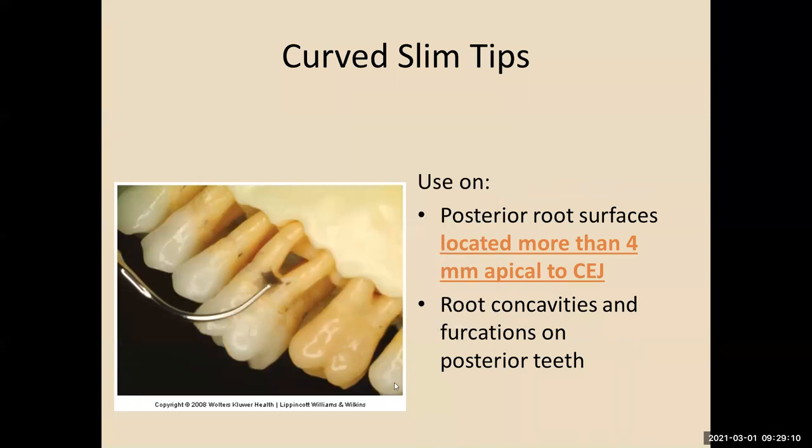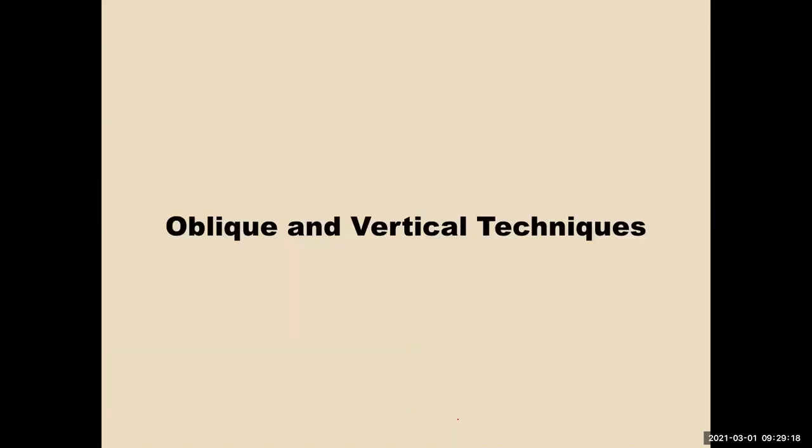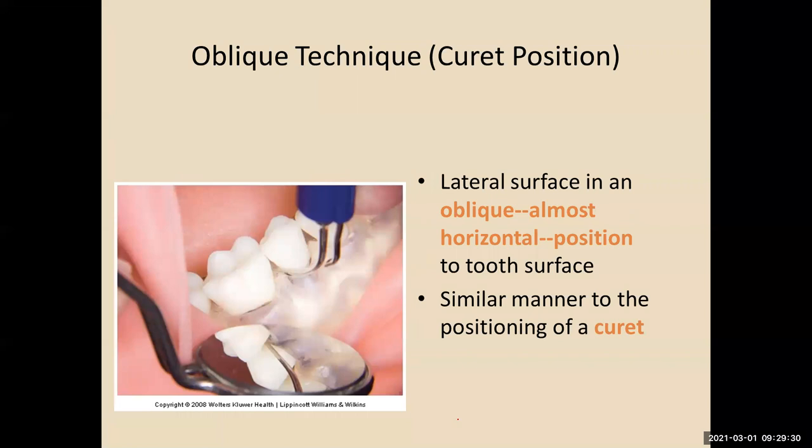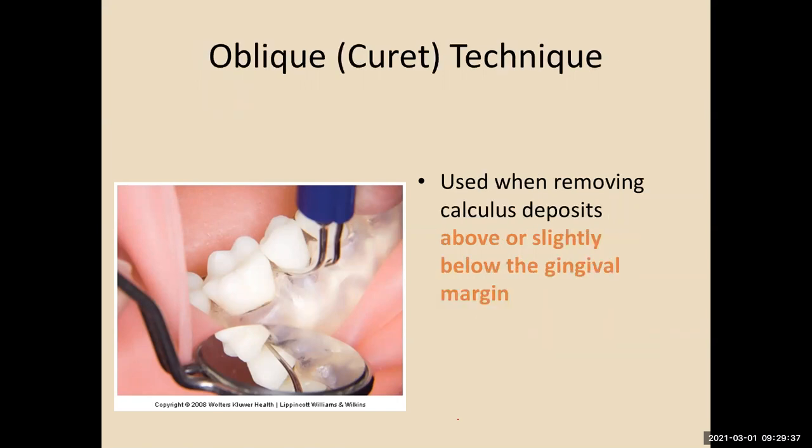This one has the ball on it for furcations and root trunks. There are different strokes that you can use, just as with your hand instruments: oblique, vertical, horizontal. When we're rocking on our fulcrum, we're naturally doing an oblique stroke.